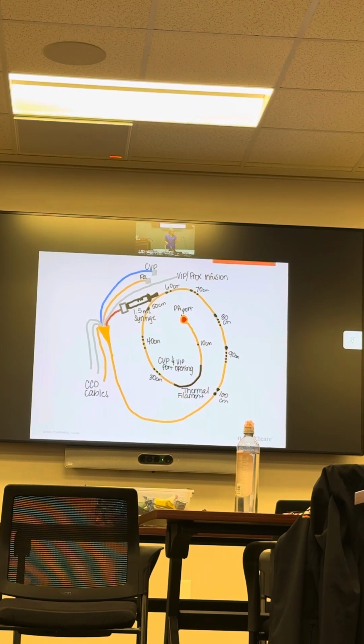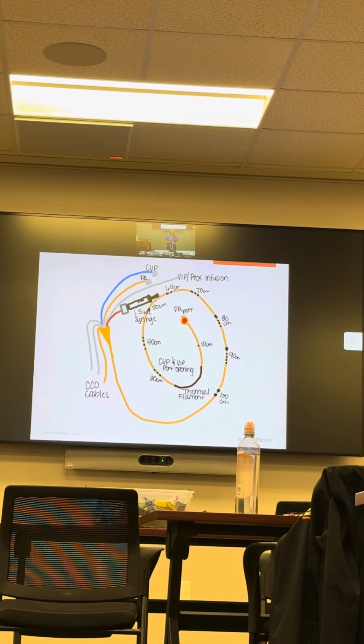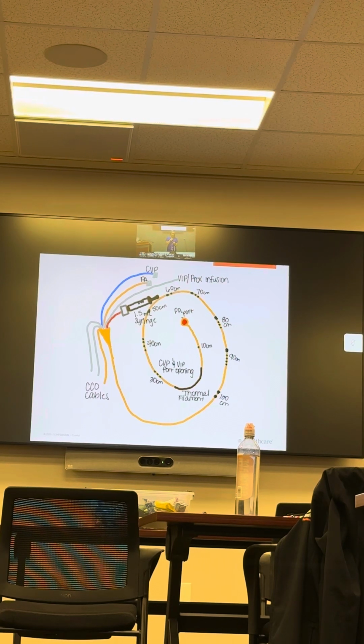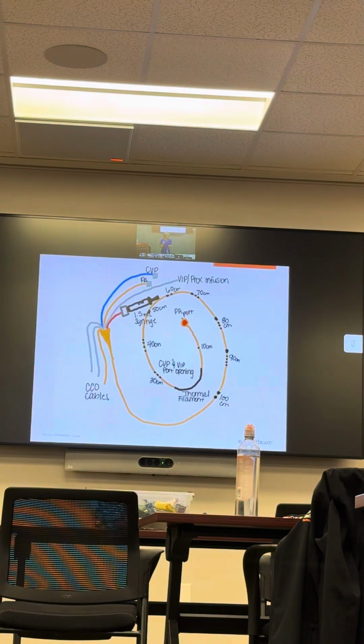The safest way, therefore, to treat this is first and foremost to know that that balloon lumen is your red port, all right? Red port denotes it's very important. Pay attention. Red port is the balloon port. Now, you just saw when I inflated the balloon, when I pushed air into that lumen, it blew up the balloon membrane. So, if I take this syringe off, am I offering any infective risk to this patient?